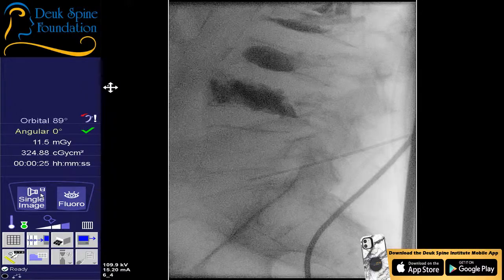All right, so just for those of you watching, we're looking at a side view x-ray. All that dark material at the upper half of the x-ray is cement, medical cement. It was put into a spine. I did not do that, someone else did. That was done for fractures of the bones.